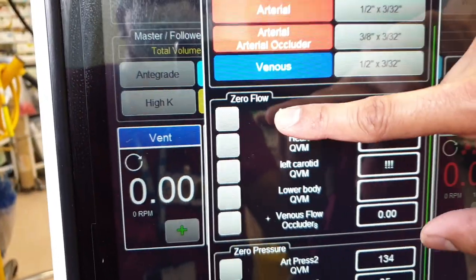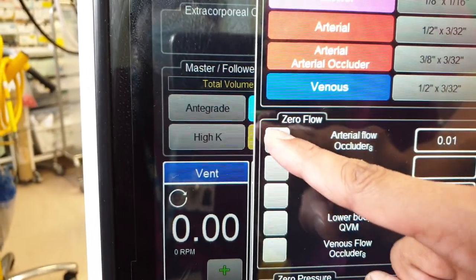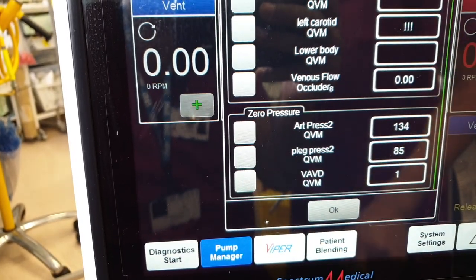Zero your flow and your pressures. Exactly zero, or sometimes negative. You can do it like here, and then you can zero both. And then you can clear. It should go to zero.